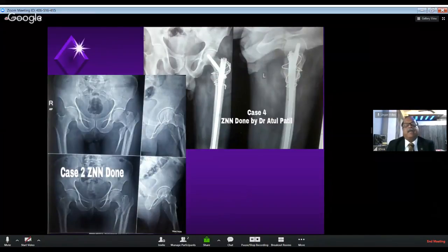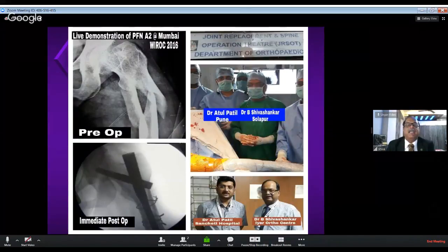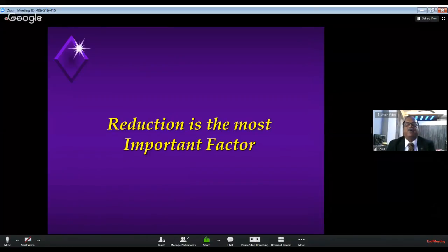If the medial fragment is very high, especially involving the lesser trochanter, and a long fragment is present, it's better to fix them. Open, wire it properly and fix them. As you can see in these cases, again a large medial butterfly fragment, it's better to fix them. Medial reduction is also very, very important because the weight bearing axis passes through that part of the bone, and if there is a gap, any implant is going to fail. Though an intramedullary implant requires a longer duration of time to fail, the gap is not accepted in the medial part.